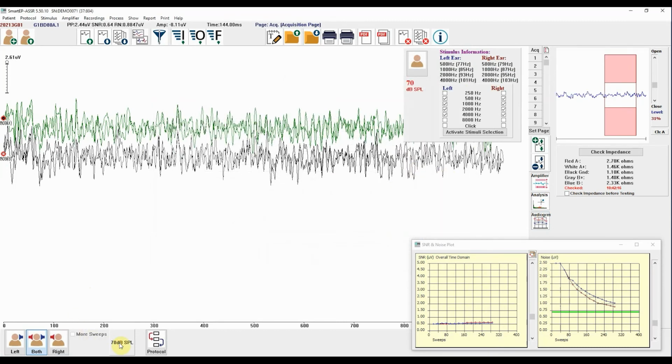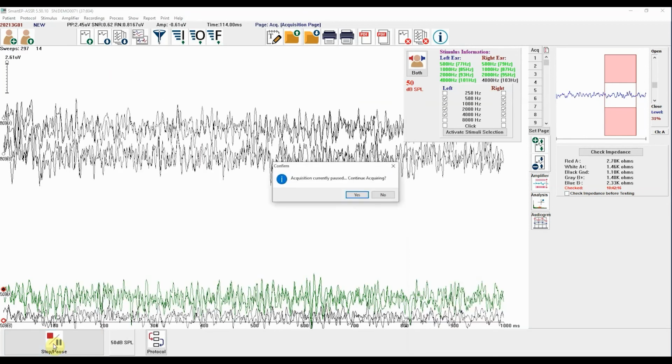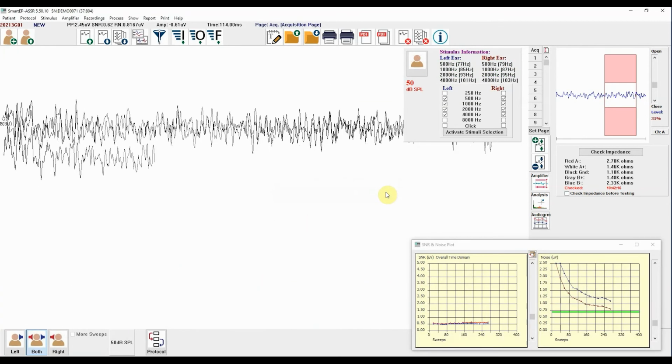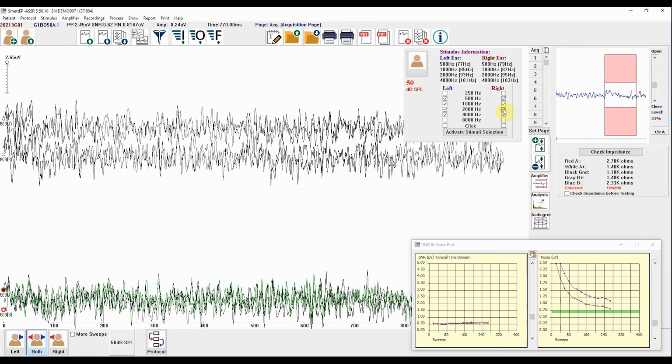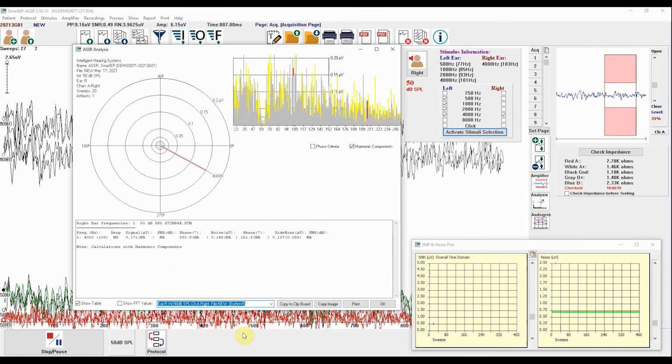Drop in 10, 20, or 30 dB steps, depending on your clinic's typical protocol paradigm. As you decrease the intensity, remove the frequencies that are not responding from your stimulus presentation configuration panel. It's better to come back and test those frequencies later. As you approach the patient's hearing threshold, it will typically be more difficult for the patient to process a complex stimulus, and you will need to begin removing frequencies from your output stimulus to reduce the complexity of the stimulation and enhance your chances of obtaining a response.